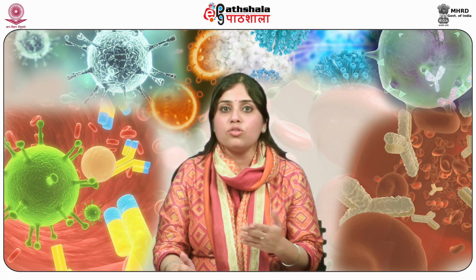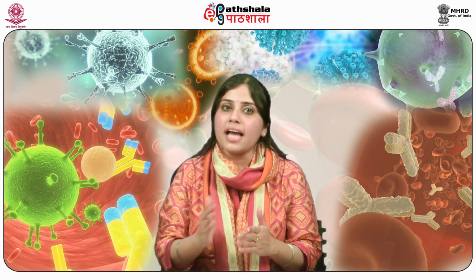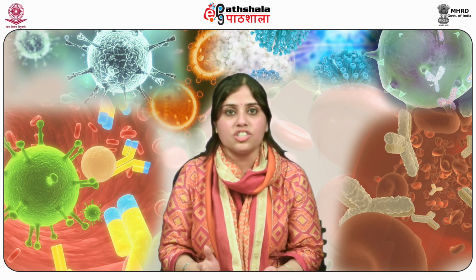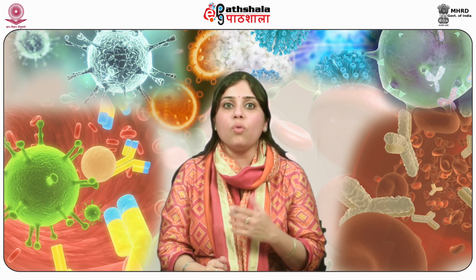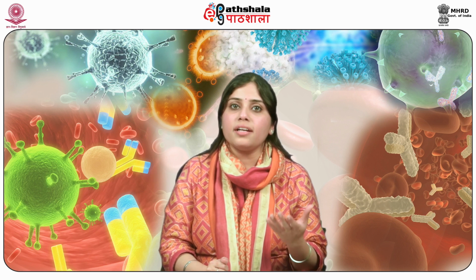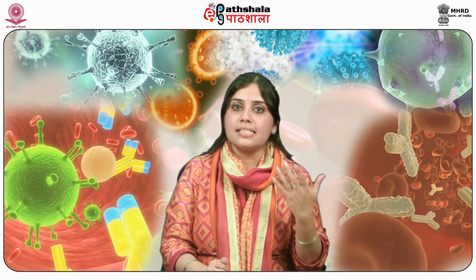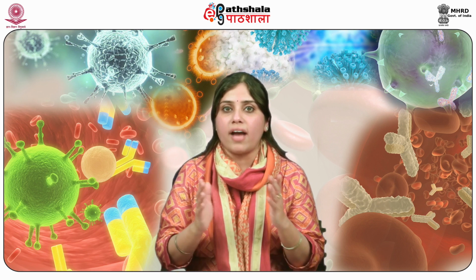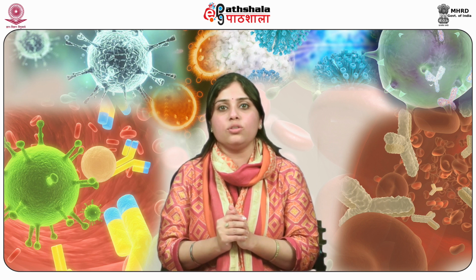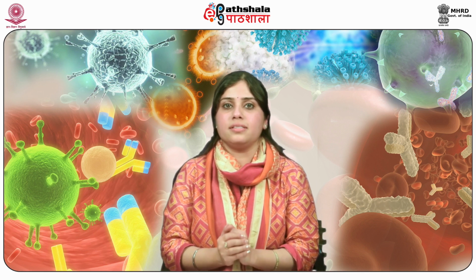Thus, the amount of an antigen in an unknown sample can be quantitated from a standard curve obtained from different concentrations of a standard antigen. If more than one antigen-antibody reaction has occurred, a corresponding number of multiple rings would form, indicating that the sample contains a mixture of antigens or antibodies. This test is commonly used for determination of immunoglobulin levels in clinical samples.